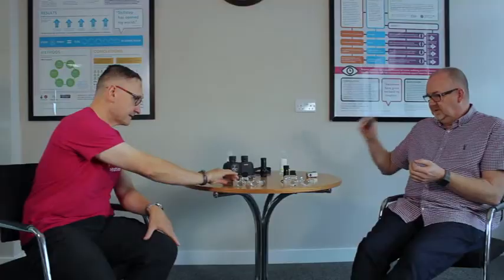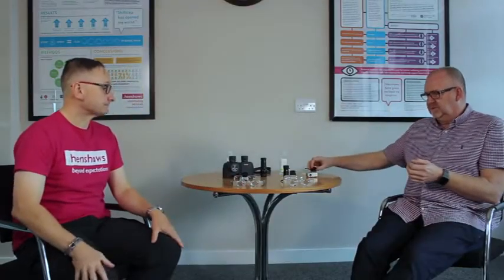Yeah. So the clip-ons are a good solution. If they work for you, it's a really good solution because you've got your hands free. With things like these, you've really got to be careful you're not in your own light. So you've got to work out your lighting, have your light coming in the right place, and not get dazzled, but your hands are free to do what you're doing. So they're for distance work. The ones here, these are for close up. Those are just close up, yeah.